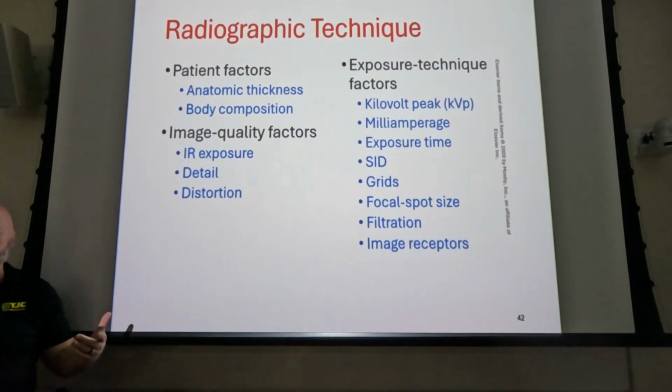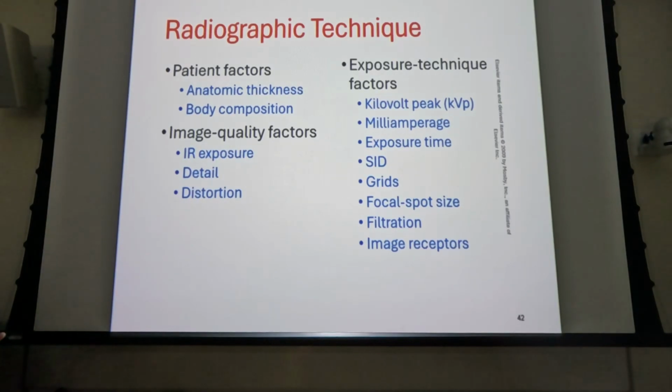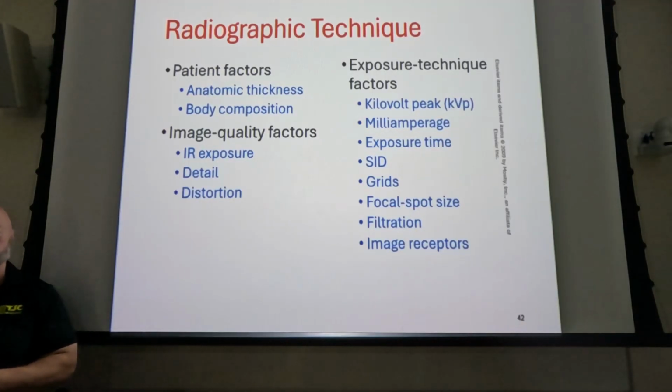Somebody said that we still have a clinical site that has CR capabilities. Is any clinical site using CR, because you have to switch out the image receptor? We have a portable, but they don't really use it. They don't use it? Yeah. I think Cedar Creek has a portable too, but we don't use it. All their machines are CR turned into DR. They just upgraded, they didn't get anything new. They just added a DR cassette, yeah.